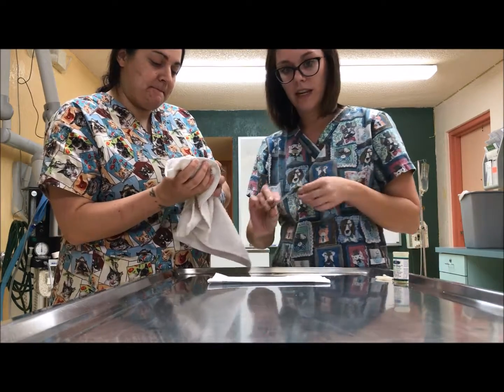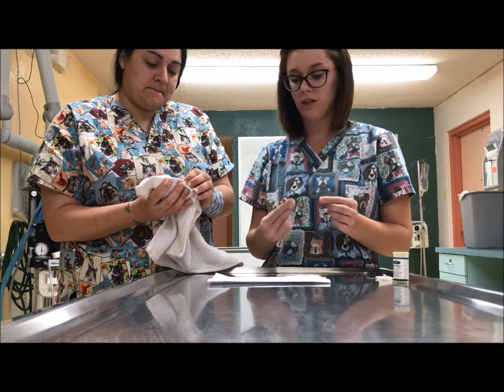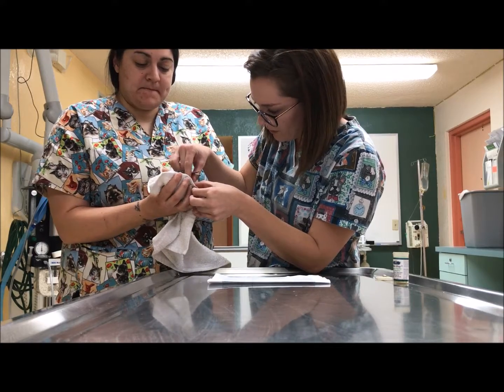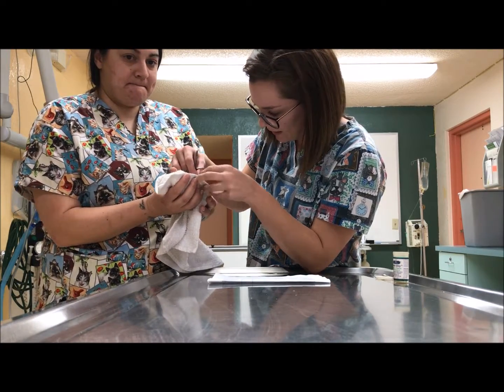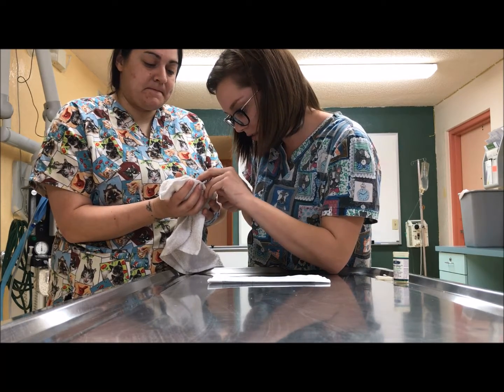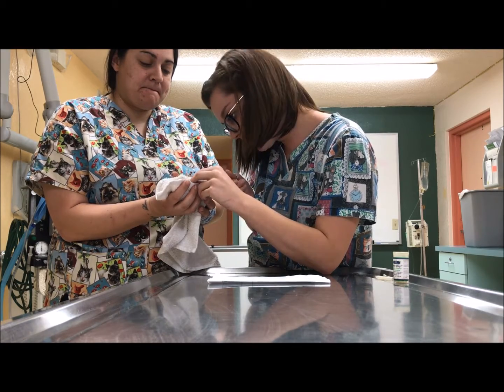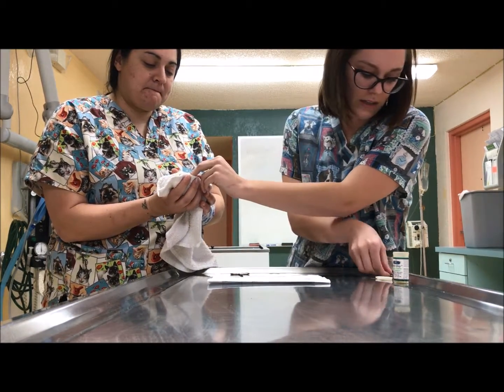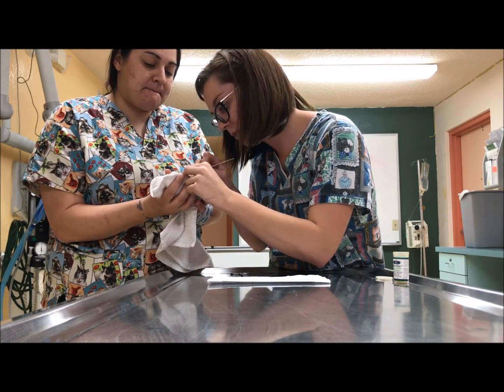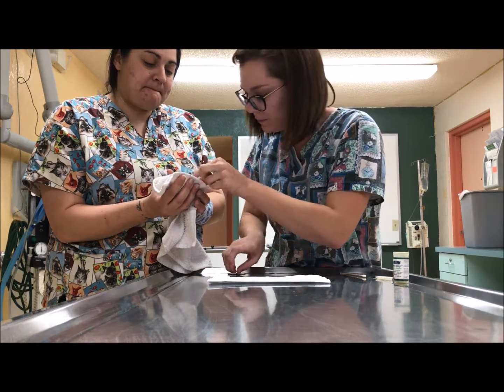So then what you're going to do is take your nail trimmers. Cat trimmers work really well, as do suture scissors, which is what I'm using right now. And then you get the little bird nails, and you take off just the littlest bit, making sure you're trimming just the nail and not another toe. And I did just quick him a little bit, so I'm going to go ahead and apply the Quick Stop before anything happens.